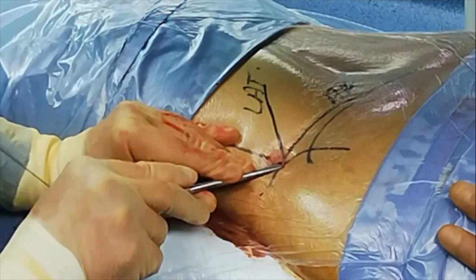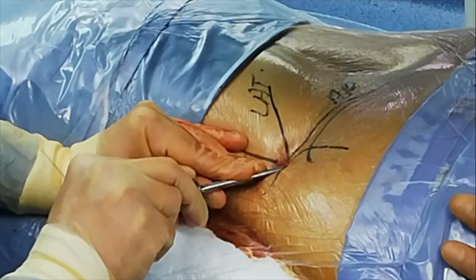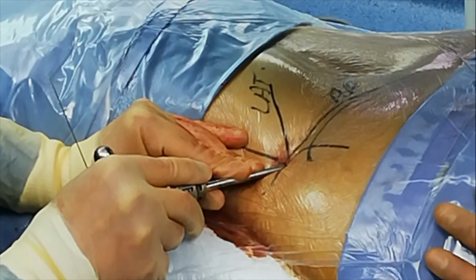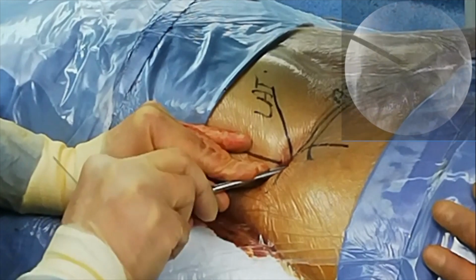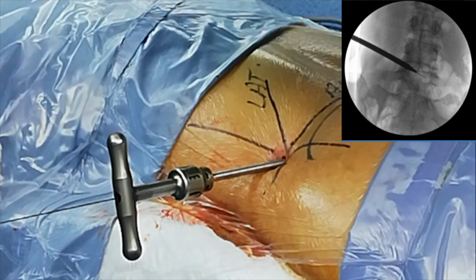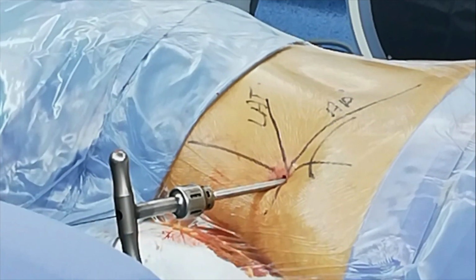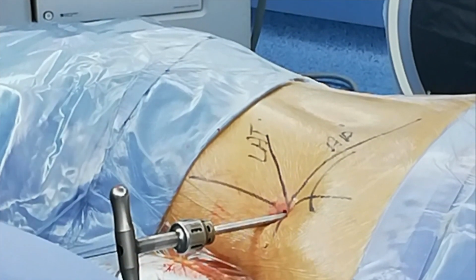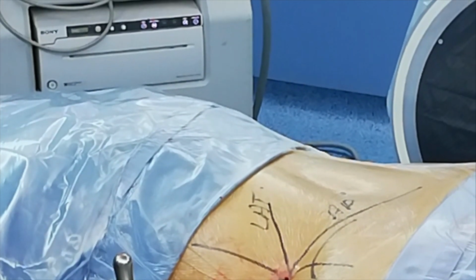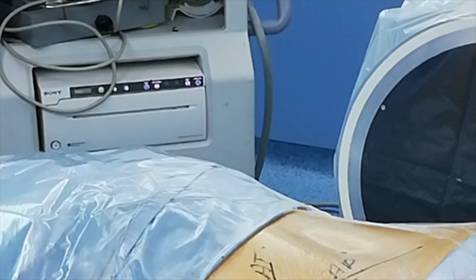So again, X-ray. X-ray please. You can see I'm approaching the medial border of the pedicle. X-ray, please. Okay, I get one lateral view, please, lateral X-ray. I really just want to make sure that my reamer is in that posterior upper corner. I want to make sure that we're not breaching the disc, not inside the disc, or really in the pedicle. So I get one lateral view during the whole reaming process, which usually takes 5 minutes.